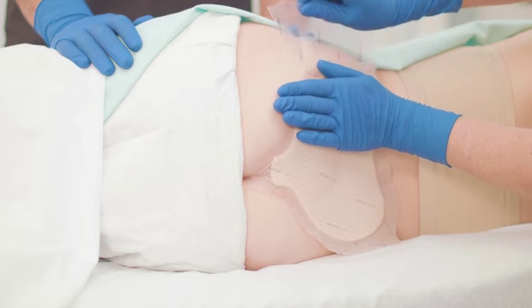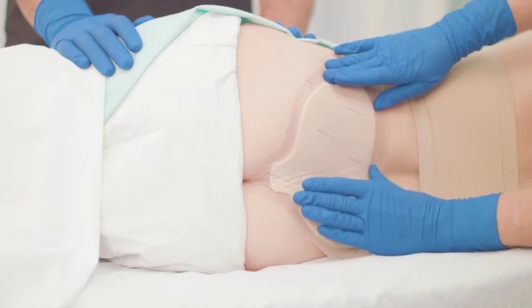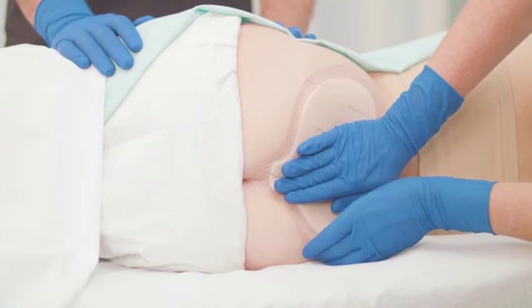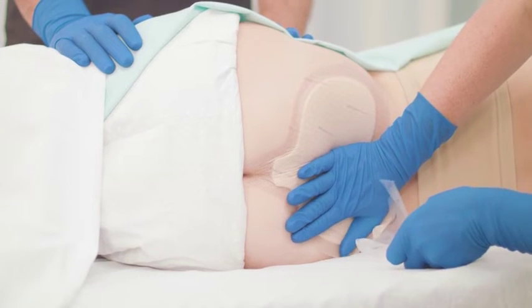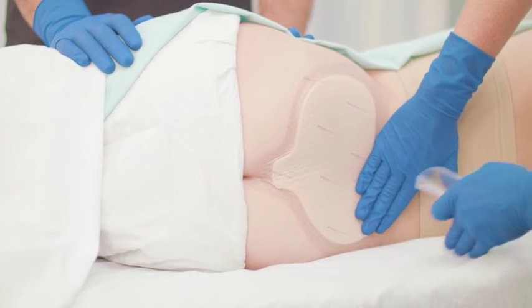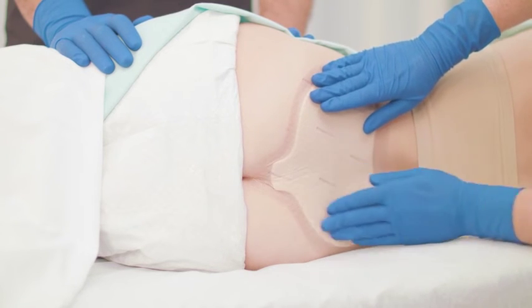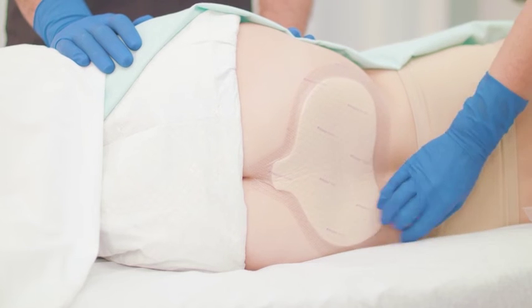Remove the side backing films and gently smooth each side of the dressing into place. Ensure that the entire dressing is in contact with the skin, smoothing the border circumferentially, which will minimize gaps or air pockets. Where external moisture such as uncontained incontinence is an issue, apply a SafeTac compatible barrier film to outside edges of dressing and onto skin.